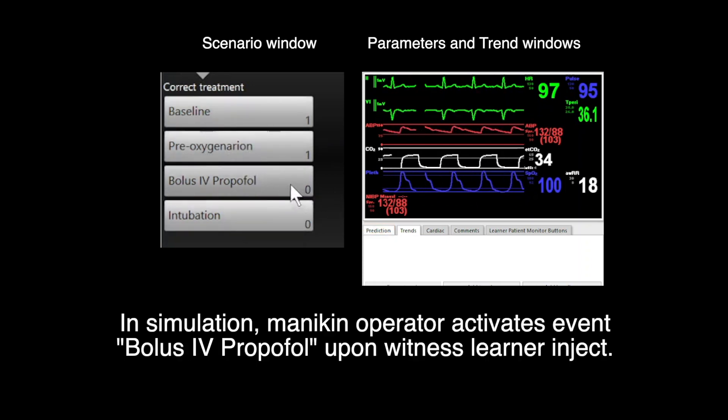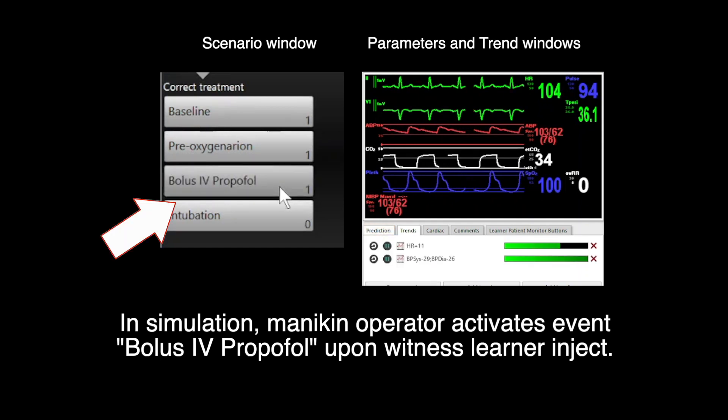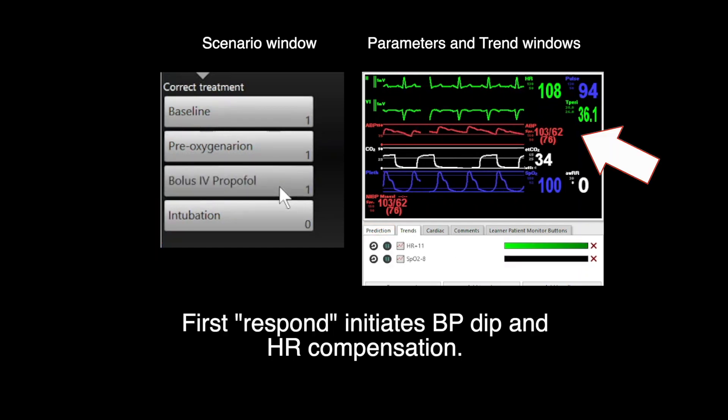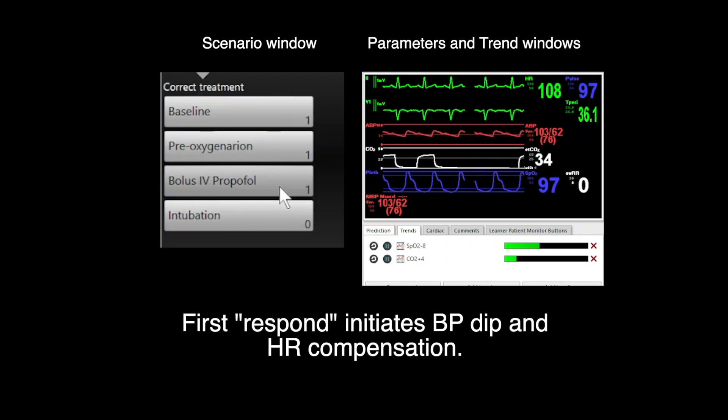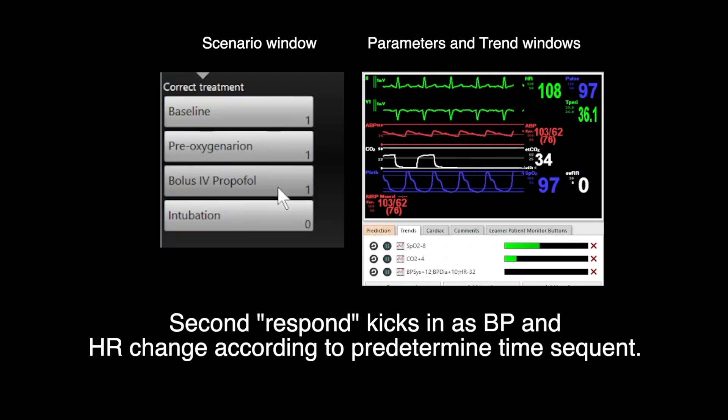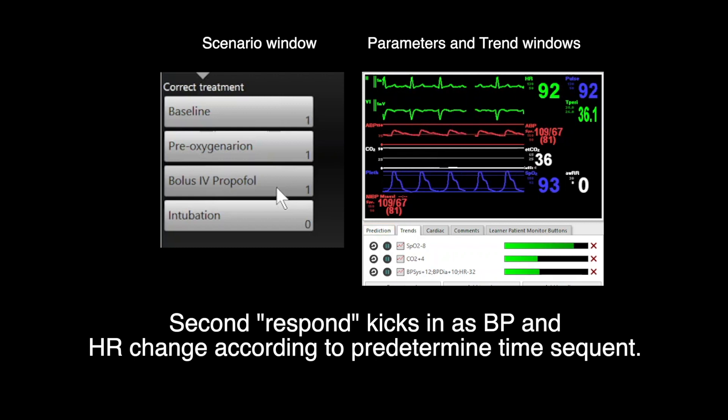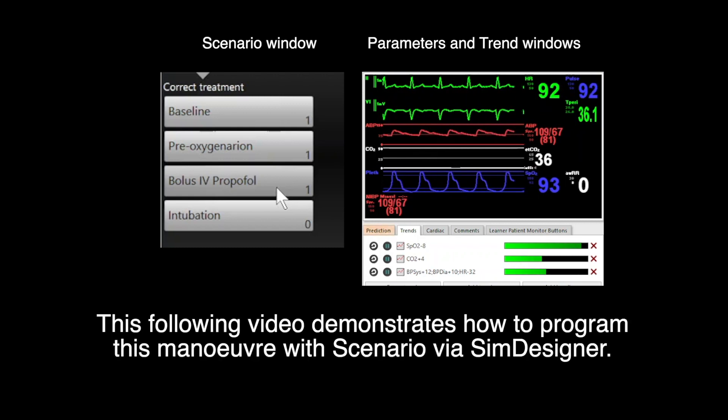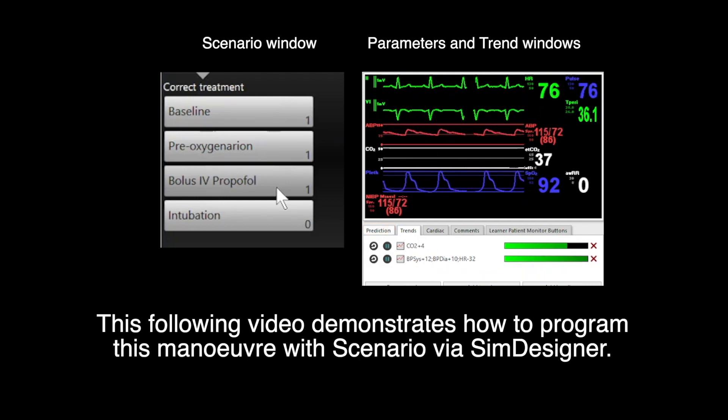In simulations, MANIKIN's operator activates event bolus IV propofol upon witnessing learners inject the medication. First response initiates blood pressure dip and heart rate compensation. Second response kicks in to normalize blood pressure and heart rate with predetermined time sequence. The following video demonstrates how to program this maneuver with scenario via Sim Designer.